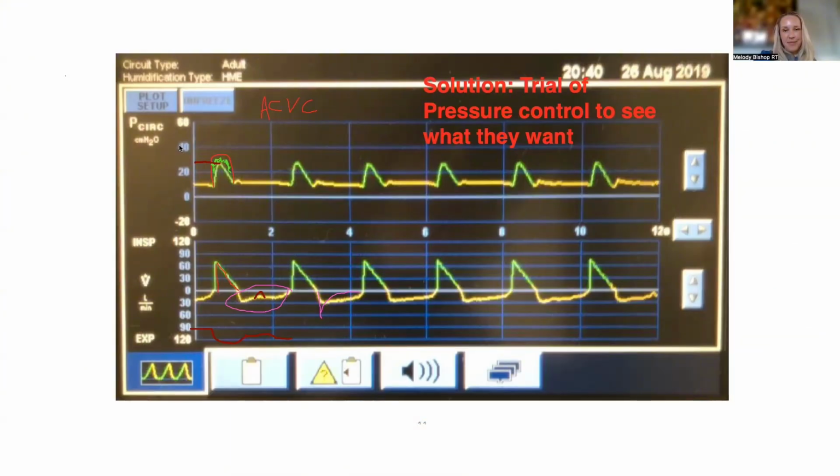And we don't know why the patient's on the mechanical ventilator, but given the amount of work they're doing, their intrapleural pressure swing is probably plus or minus 15, right? Which is a massive amount of intrapleural pressure swing for the lung to see, as you mentioned, P-SILI, the patient self-induced lung injury, made famous by our late friend Gattinoni, may he rest in peace. But it certainly is an issue, right?